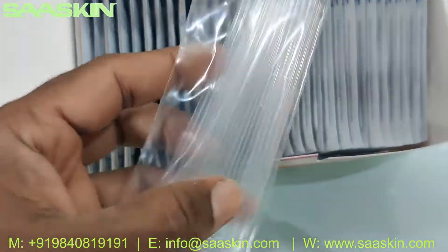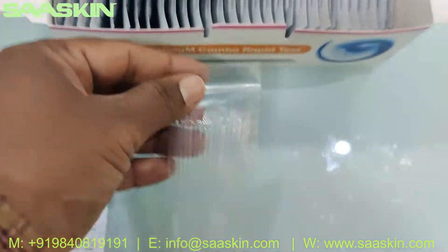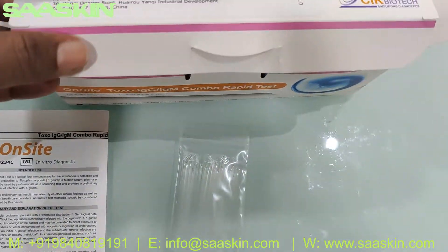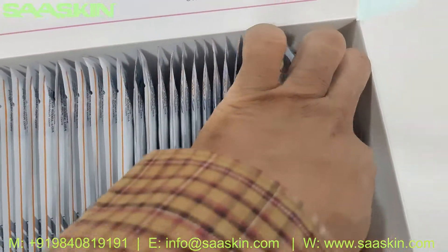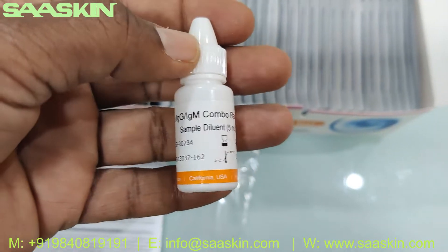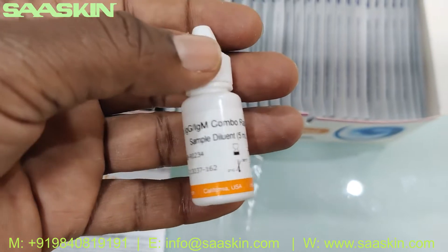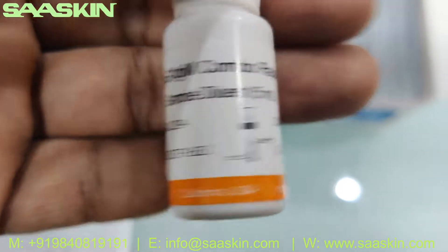Inside you can see the test cassettes and the capillary tubes — you get 30 capillary tubes and 30 test cassettes. You also get one buffer bottle for the Toxo IgG IgM Combo Rabbit Test — the sample diluent buffer, which is a 5 ml buffer bottle.